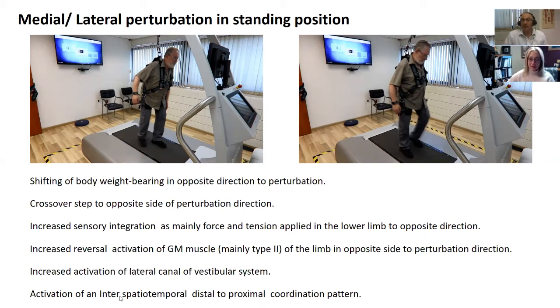We just got up to this slide where we're going to describe body weight shifting during standing and during gait, and obviously different types of reactive responses, and what we can actually see, and how we can customize our perturbations to actually initiate the reactions that we want to initiate in order to improve balance and gait, and general deficits in general walking ability as well, obviously.